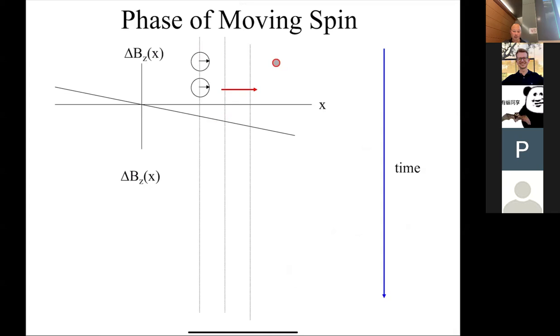Okay. So this topic now is sort of, we're going to just touch upon, give you a sense of what happens with flow. And so we saw this picture yesterday or on Monday with diffusion, right? So now we're going to talk about more bulk flow. With diffusion, it was random motion, right? But with flow, there's some concept that you know what's happening, right? Things are going in a certain direction. They're not just randomly moving around. So in this case, we're going to assume that there's something that's not moving, like the tissue, and then there's something that's moving, like the blood, right?